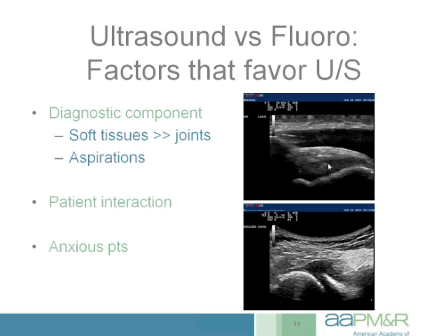In terms of needle guidance, if you were looking to compare doing a bursal injection with ultrasound versus fluoroscopy, I think ultrasound would be superior without much comparison, in that you can distinctly see the bursal sac and opening here, and you'd be able to walk a needle in from lateral to medial and exactly land right in the bursal sac, which is very nice.